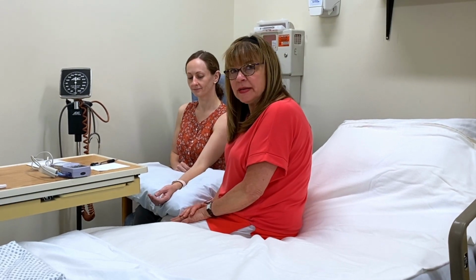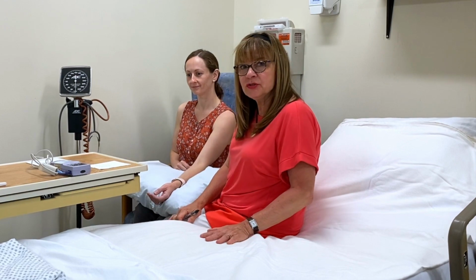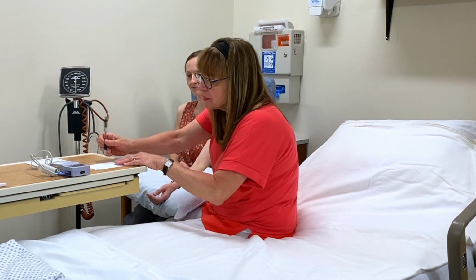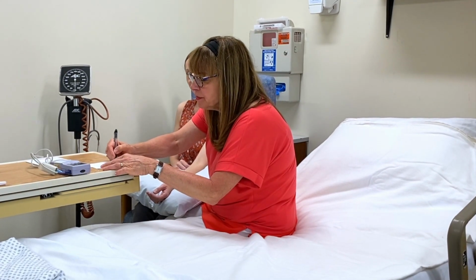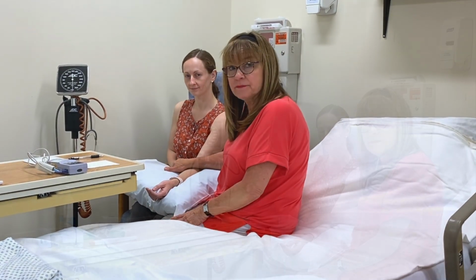Monique's respiratory rate is 12. That falls within the normal guideline of 12 to 20. Now the next thing I'm going to do with Monique is I am going to take Monique's blood pressure.